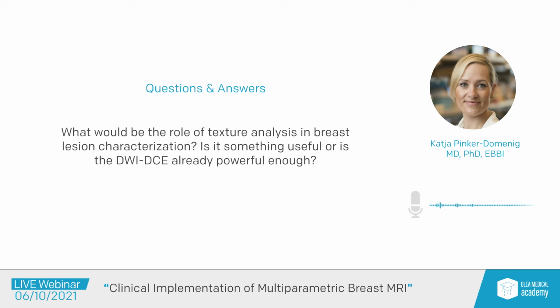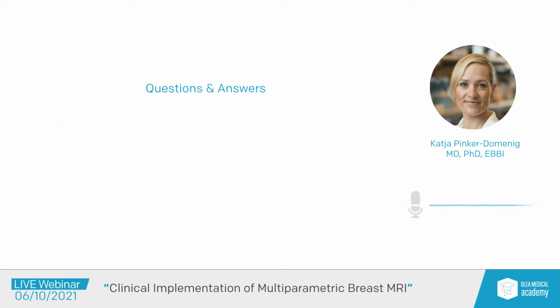I have seen that there are questions where it will add, because we have multiparametric MRI, but we're still looking at it with our radiologist's eye. We know that with human perception, there are things I cannot see, I cannot decipher based on my qualitative assessment alone. So adding quantitative assessment, with the aid of the machine, will, I think, provide further information. And down the line, I think it will be there. The reason why it has no standing at the moment is because there is no solution that is applicable in clinical routine.